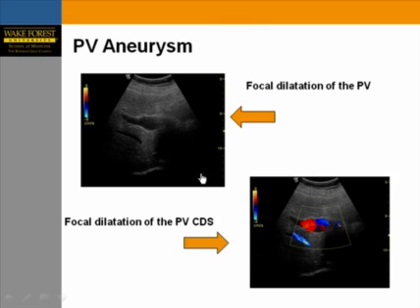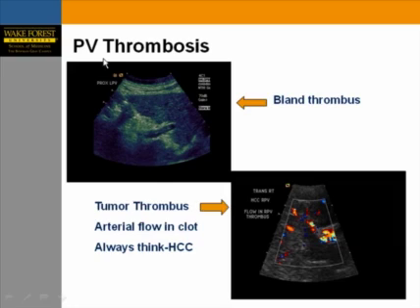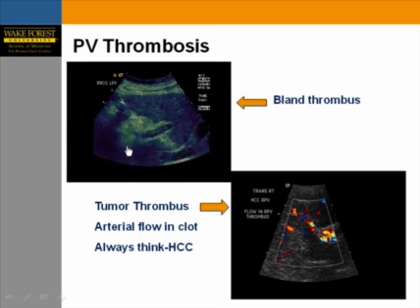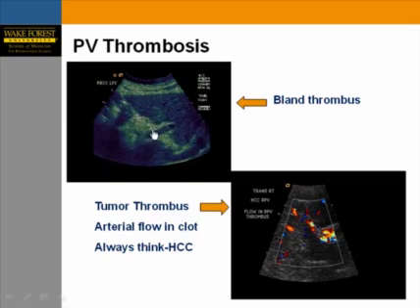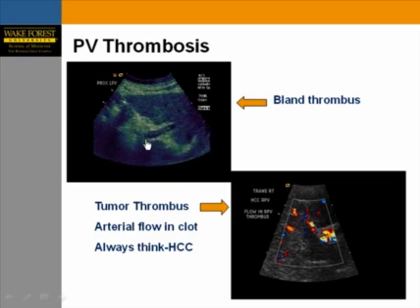Here is an example of a patient with portal venous aneurysm. On color Doppler, you can see mixing of signal within the dilated aneurysmal component — a known complication of long-standing portal hypertension. In patients with advanced cirrhosis, blood clots in the portal system may occur. A gray-scale image showing echogenic material within the portal vein without expansion indicates a bland thrombus.